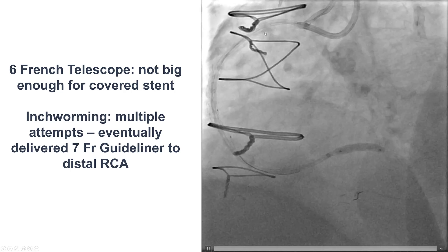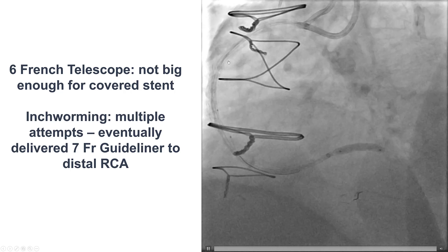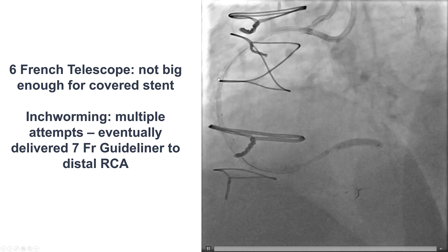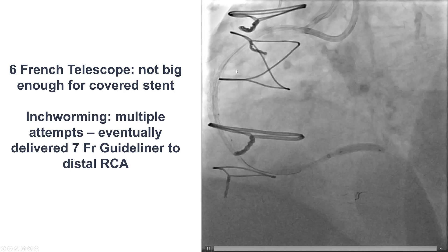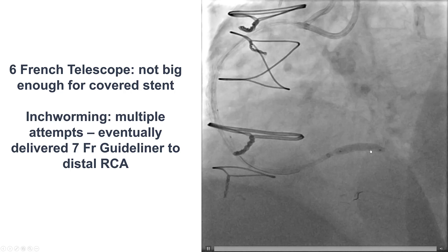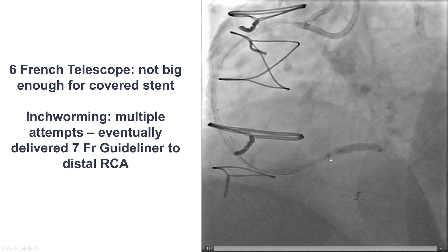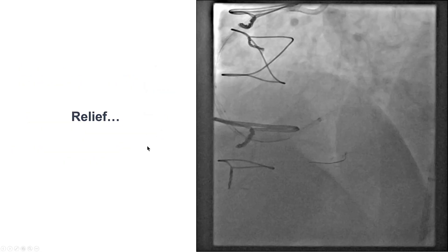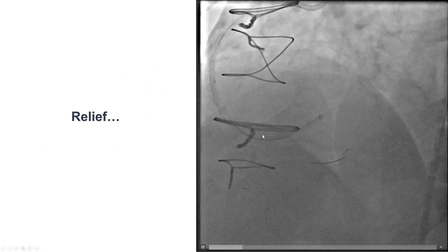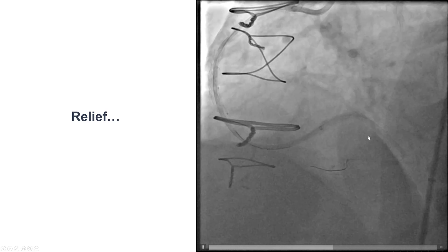Our only hope was to get a 7 French guide extension all the way to the area of the perforation. That was extremely difficult — it took almost half an hour, a lot of inch-worming, a lot of ballooning, a lot of dual hand technique and independent hand technique. But eventually we were able to deliver the guide extension all the way and deploy a covered stent, which fortunately successfully sealed the distal perforation.